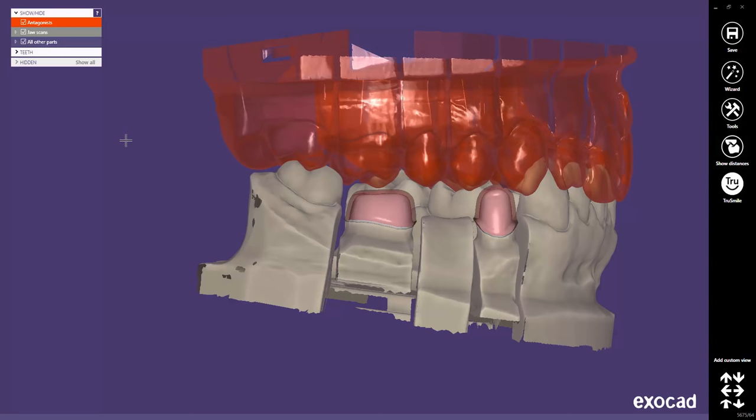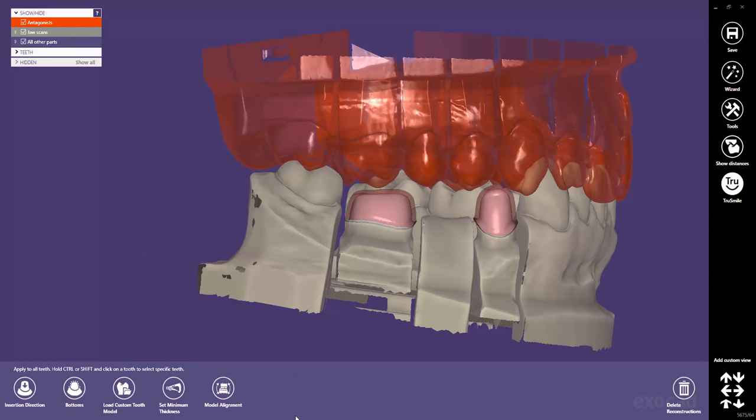Before we continue, I want to inform you that if you move the cursor on the expert toolbar without any tooth selection, parameters changed in the expert mode will be applied to all teeth.